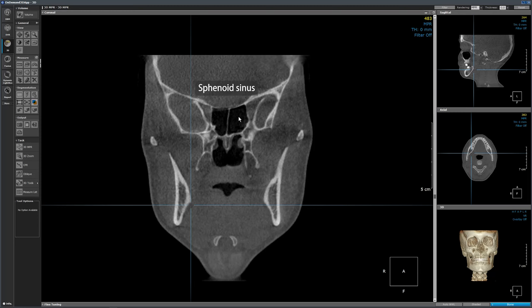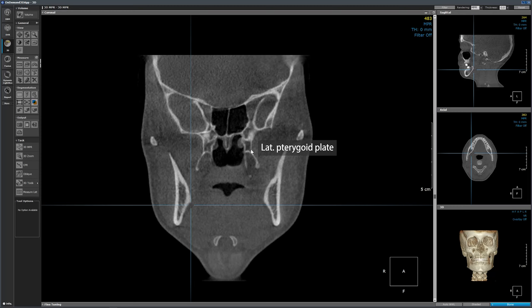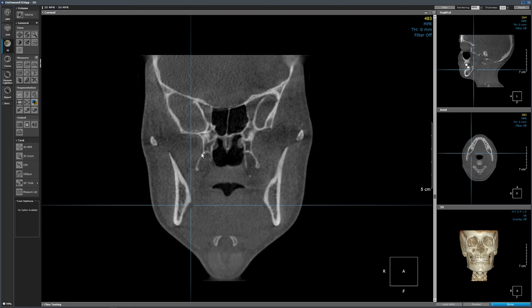The sphenoid sinus has two compartments, one larger than the other, divided by a septum. On this slice, we can also see the pterygoid plates. This is the lateral pterygoid plate and medial pterygoid plate of the left side, and this is the lateral pterygoid plate on the right side. This is the zygomatic arch.